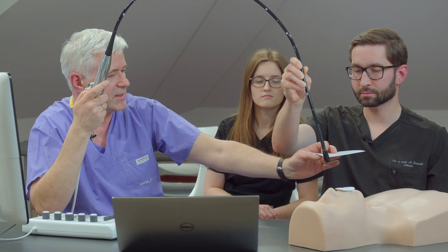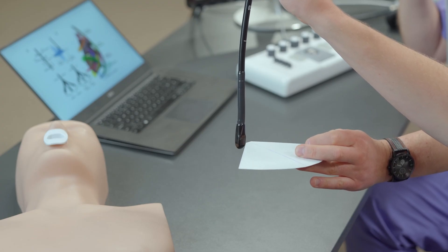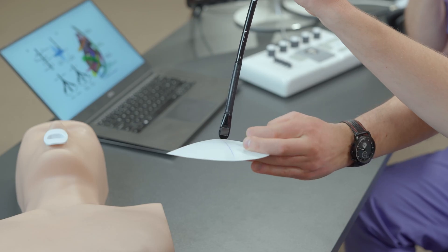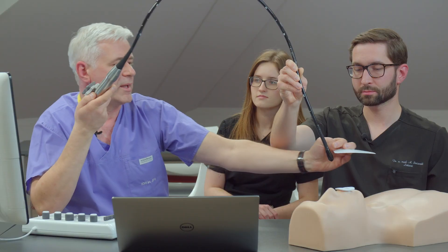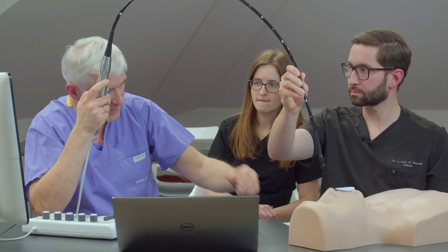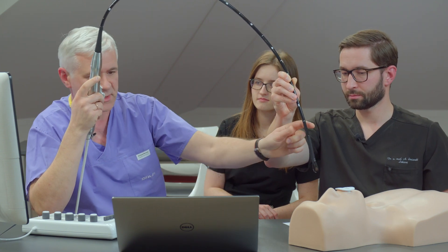The easiest to understand is the transverse view because then you have really easy control of where you are. If you just insert deeper or shallower and rotate right or left, you can control this very easily. The other things are a little bit more complicated, but you will learn them very easily.